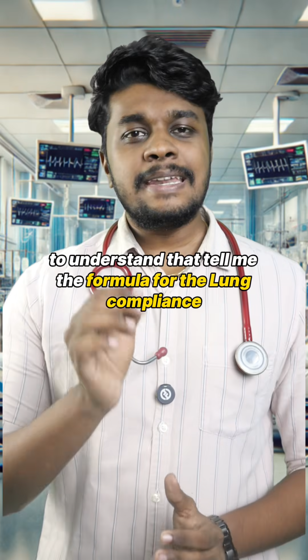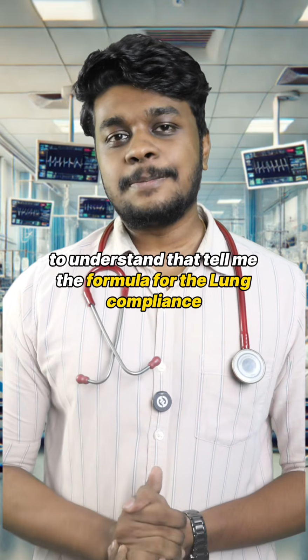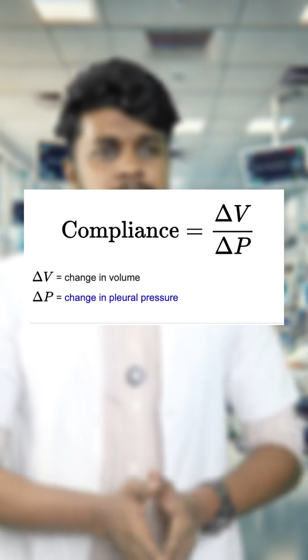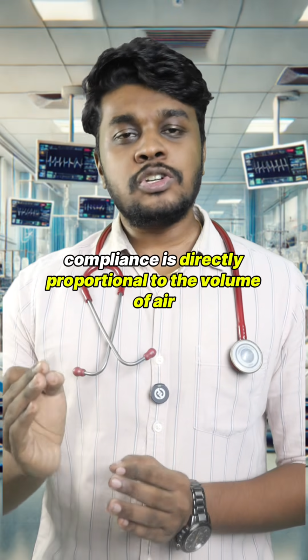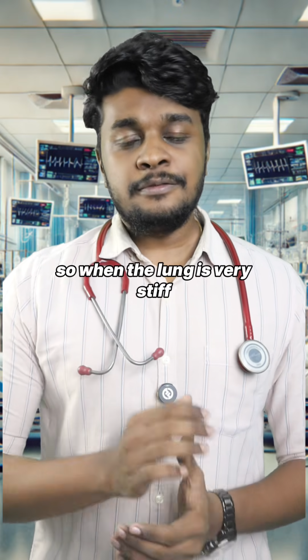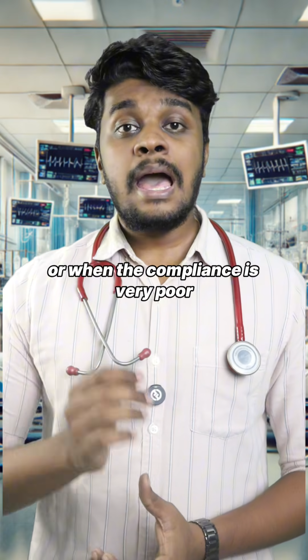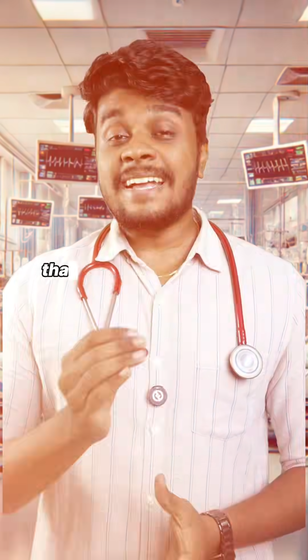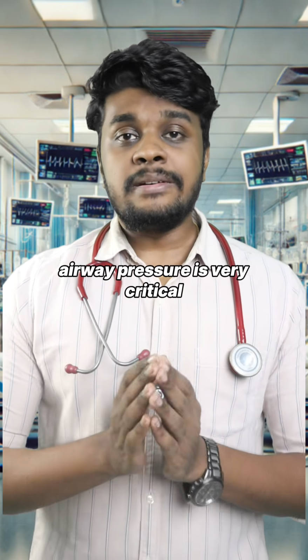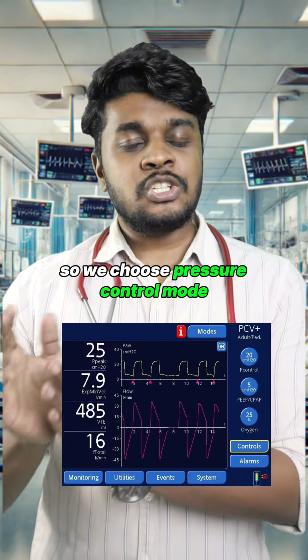To understand that, tell me the formula for the lung compliance. Compliance is equal to change in volume divided by change in pressure. Very good. So compliance is directly proportional to the volume of air and inversely proportional to the pressure. So when the lung is very stiff or when the compliance is very poor, a high amount of pressure is needed. That's why in conditions like ARDS, where the lungs are very stiff, airway pressure is very critical. That's why we choose pressure control mode.